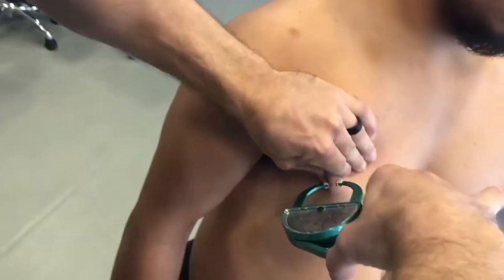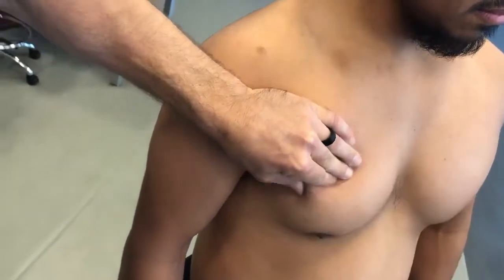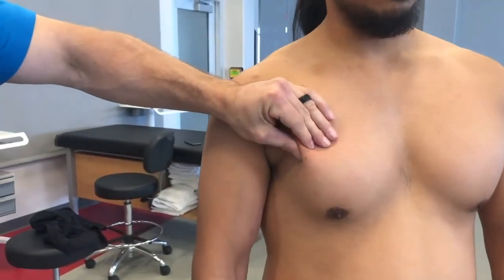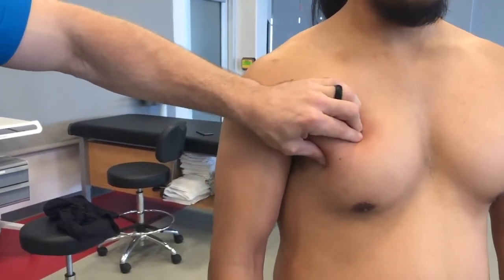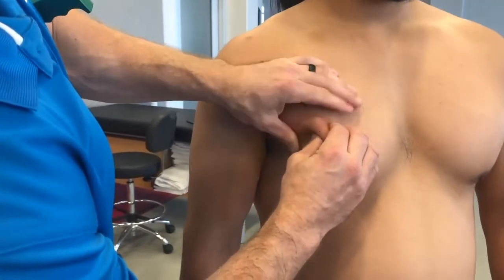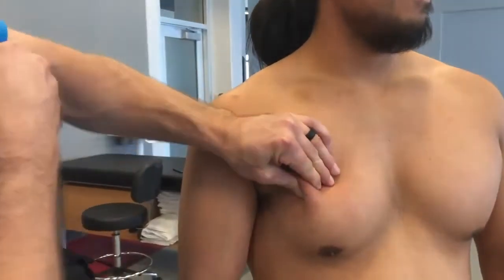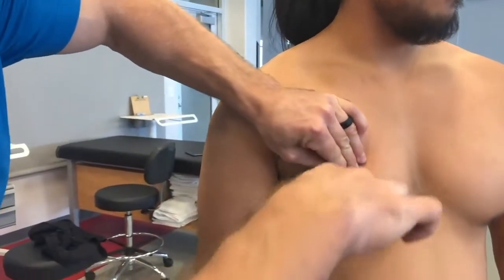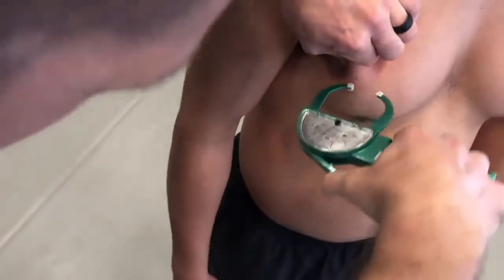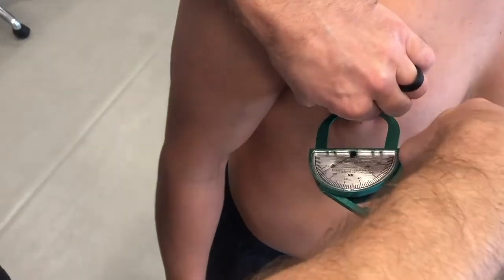When pinching, it's important that you don't come out away from the skin or go in too deep. Some individuals' skin may be a little more oily, so you might see that your grip will start to slip away — you have to be really aggressive with your hands. You could potentially use both hands to take a deeper pinch, which is going to be pretty painful. Now that we have the pinch, we're going to put the calipers midway between and hold for a count of two seconds — one thousand one, one thousand two.